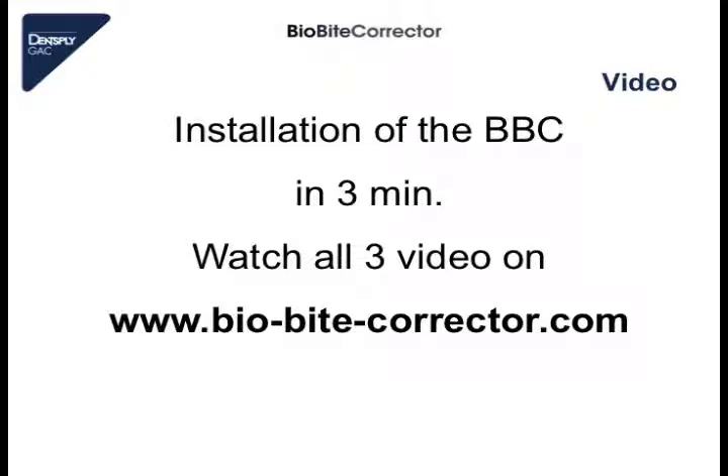Now we start watching a video. It shows how we mount the BBC in real time in 3 minutes, and at the beginning of the video there are demonstrated some important preconditions. On the BioByte Corrector website there are also other videos uploaded, and I advise you to watch all these videos because they are very important to work successfully with the appliance.